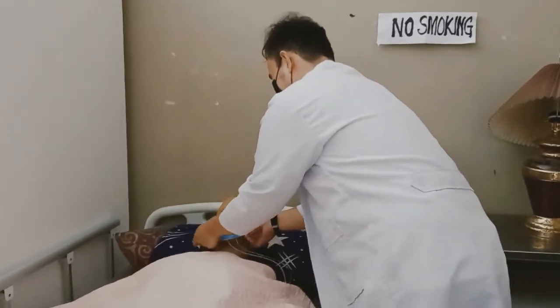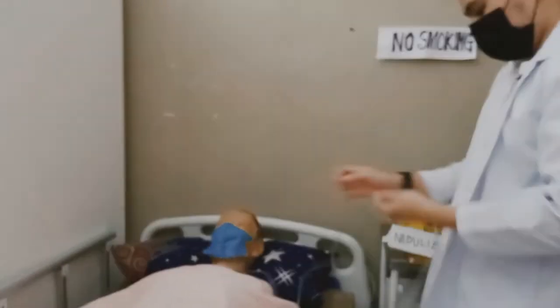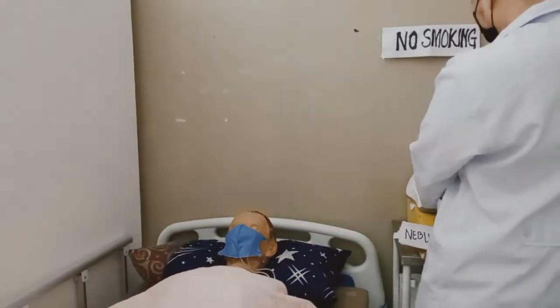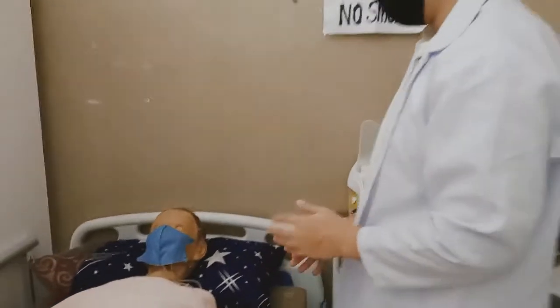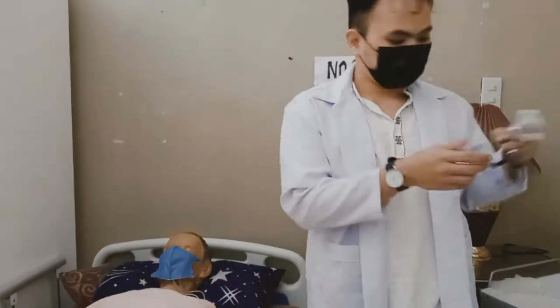Attach one end of the tubing to the stem on the bottom of the nebulizer cap and the other end to the air compressor or oxygen. Turn on the air compressor or oxygen. Check that a fine mist of medication is produced by opening the valve. Have the patient place the mouthpiece into the mouth and secure it with the teeth.